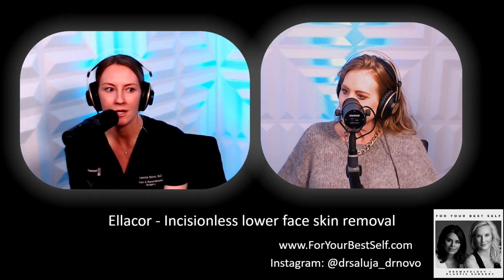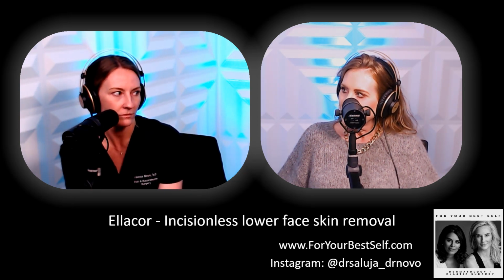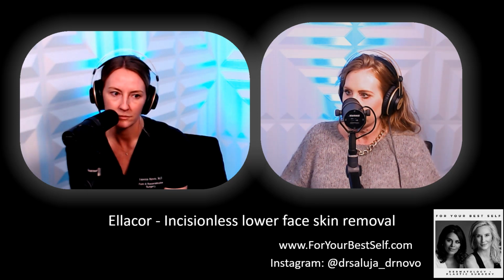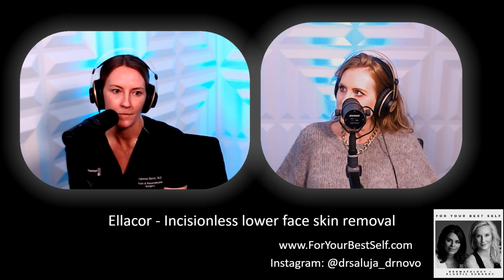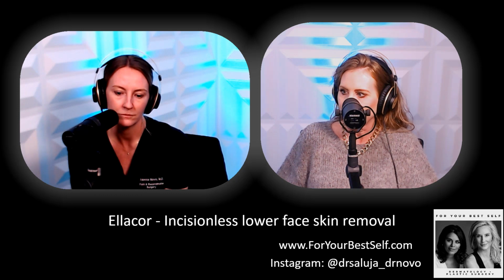So once we get past that, the feeling is really pressure. It is pressure. Probably the most uncomfortable portion of the entire procedure from the beginning to the end was the lidocaine injection. Yeah, and that was uncomfortable, but it was certainly manageable. And from that point on, I was numb.